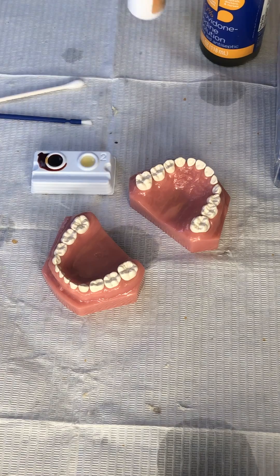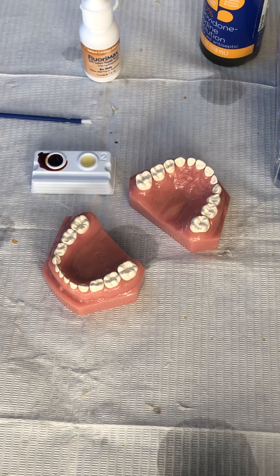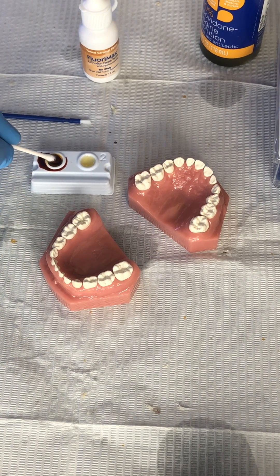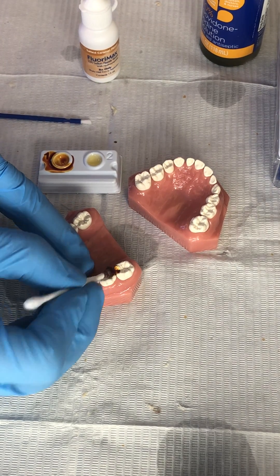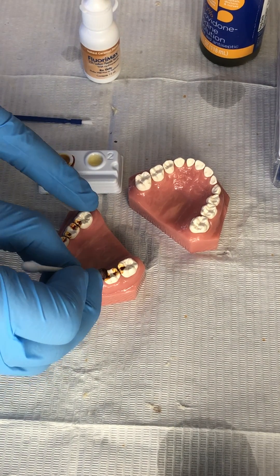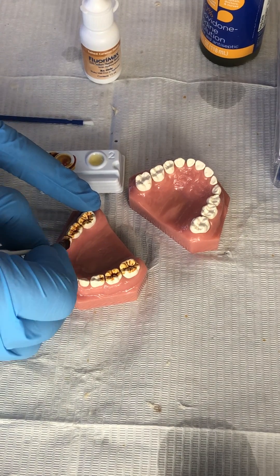We're just going to put iodine onto the teeth first and then cover that up with fluoride varnish. You would dry with a two-by-two, and I like to let the iodine soak into my cotton applicator or Q-tip, then find the highest-risk surfaces and kind of push there. So let's say this kiddo is really at risk for interproximal lesions — you can just push that in a little bit there.